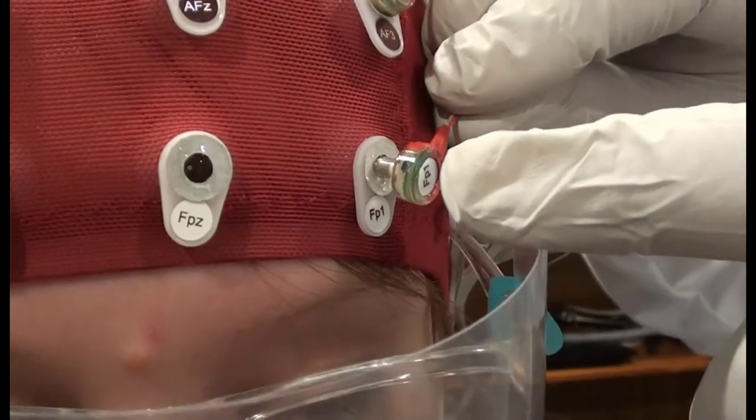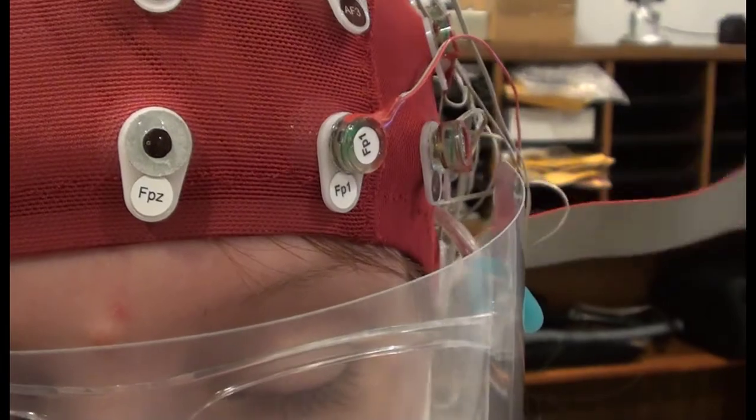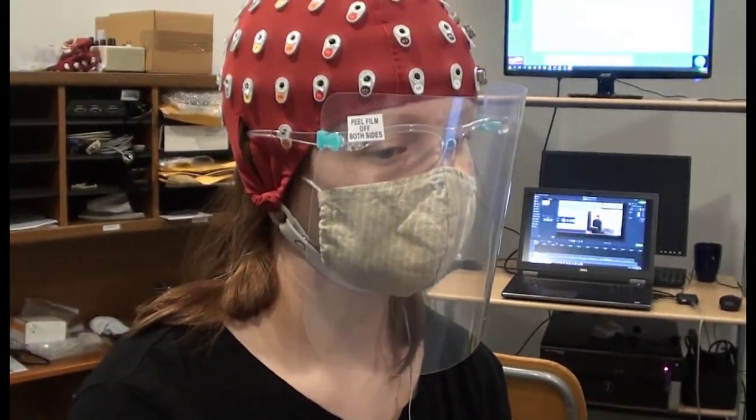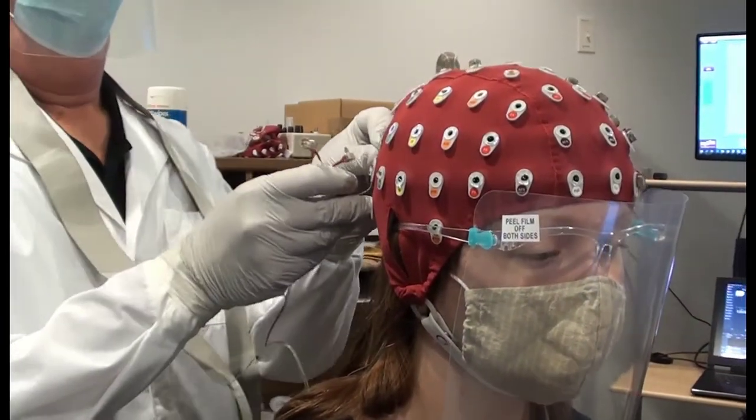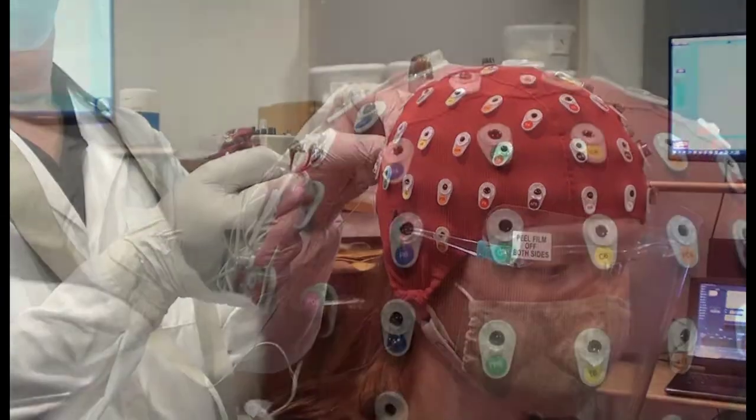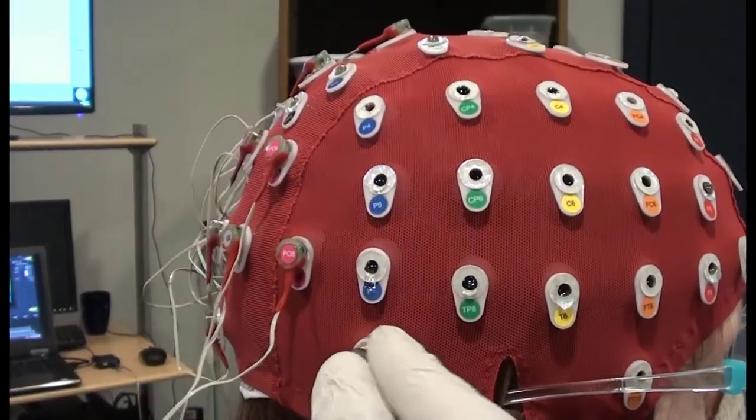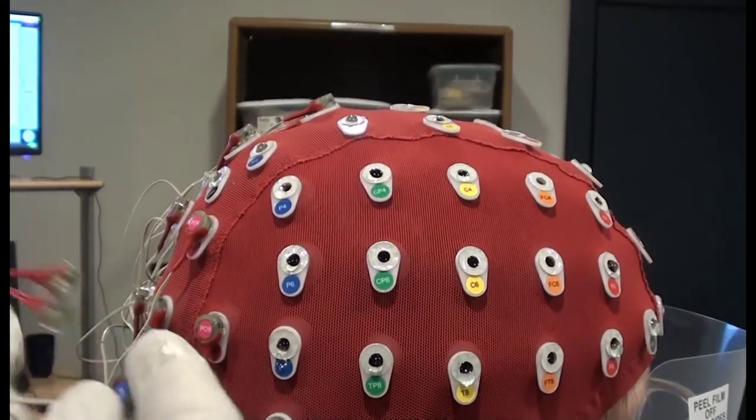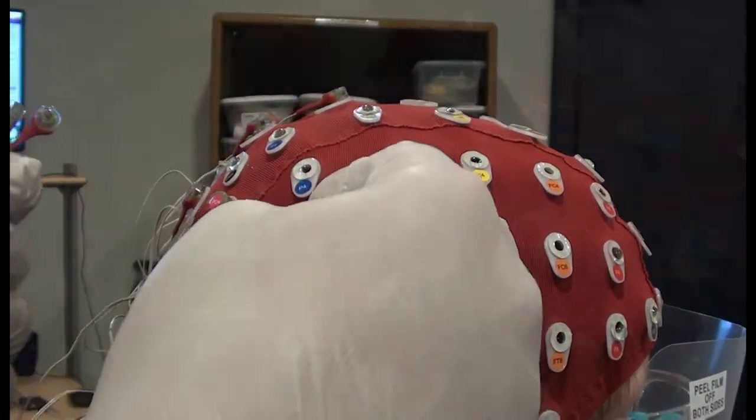When you handle the electrodes, try to avoid putting strain on the wire electrode junction, because that is the most common failure point on the electrodes in the long run. The electrodes shown here are of the new reinforced type, which are highly durable and almost never break. Because the wire near the electrode is reinforced, you will find that it makes sense to orient each electrode in its holder with the wire going toward the back, where the AD box should be located.